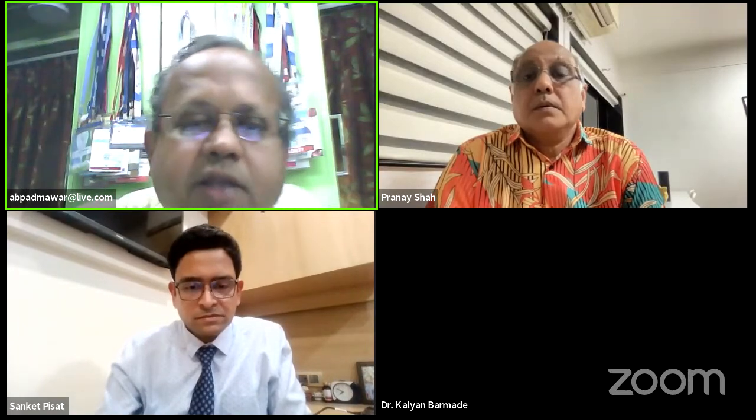Thank you, Dr. Sanket. It was an interesting insight again into the ultrasonic energy, and you covered all the points which pertain to it. The only disadvantage, as one can say, is that it is not a reusable instrument. I think the sonic beat and the thunder beat are supposed to be reusable, but the ultrasonic by J&J is a single-use instrument, and that makes the costing of the surgery a little formidable unless it's covered in the insurance part.